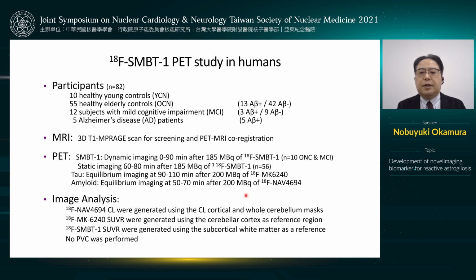These subjects underwent SMBT1 PET, amyloid PET, and tau PET scans. For imaging analysis of SMBT1, we generated SUVR using subcortical white matter as a reference region.